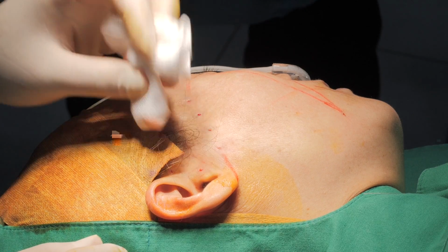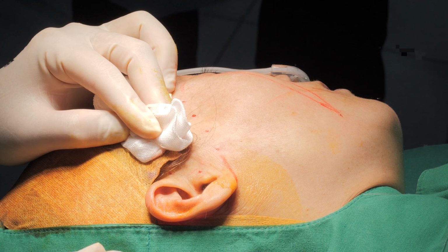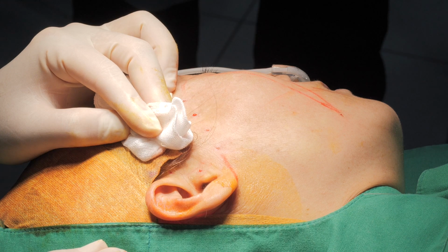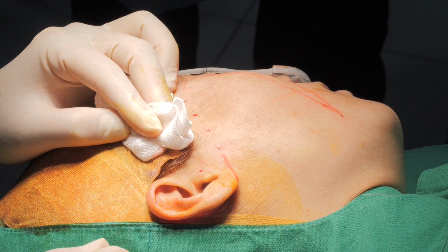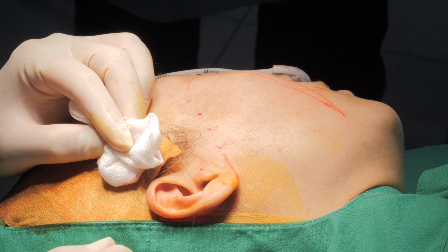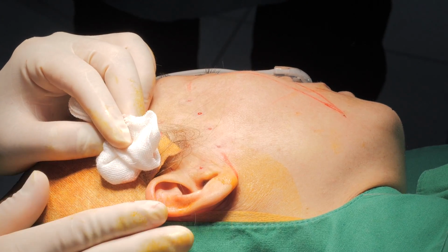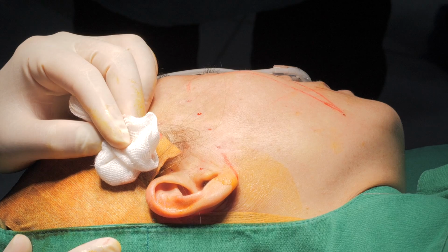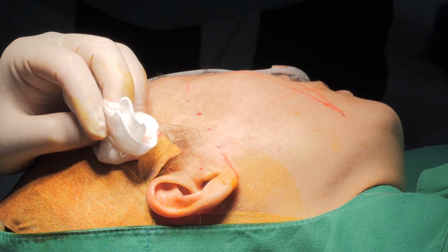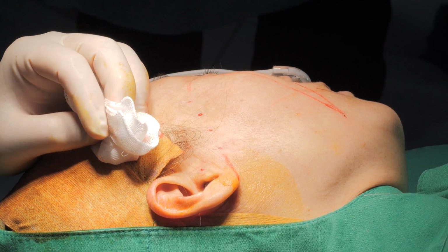On a scale from 1 to 10, being 10 the best, with the threads that you have already placed, what will be the improvement? For her, maybe 3 to 4. Yes, I apply a lot of threads for severe cases, almost 50 to 60 for one patient.